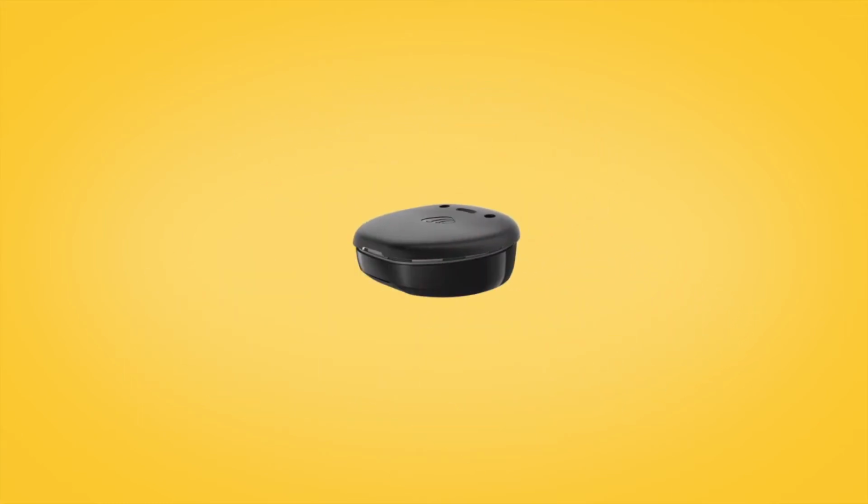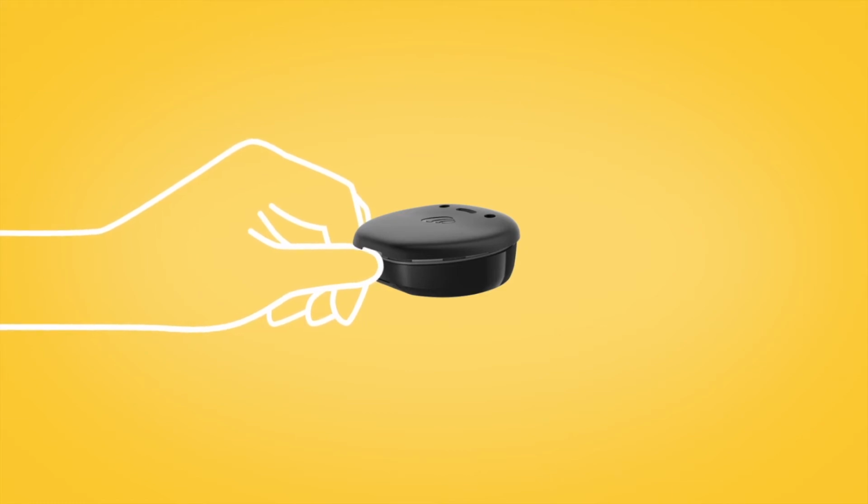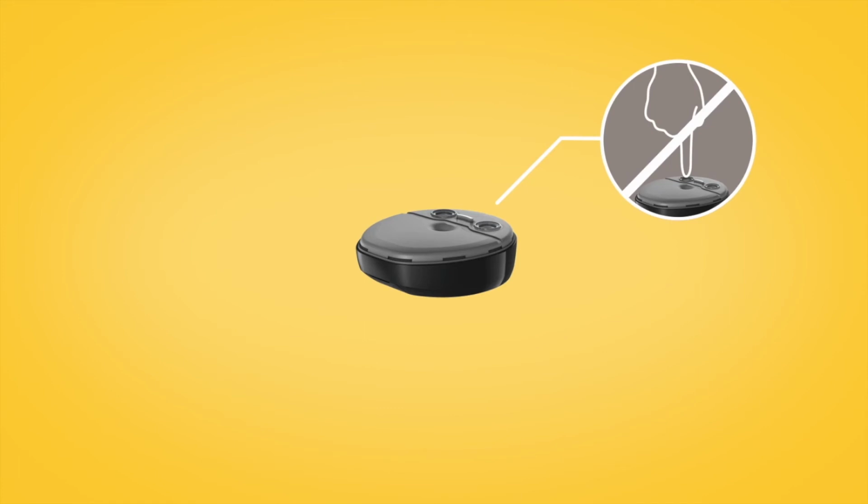To replace the microphone cover, remove the cover from your Kanso 2 sound processor using your thumbnail in the slot provided. When the cover is removed, the sound processor's sensitive microphone filters are exposed. Do not touch the microphone filters, as this could cause damage to your sound processor.